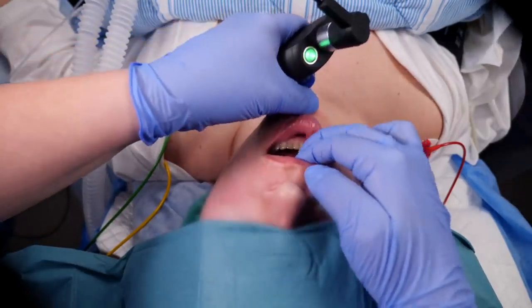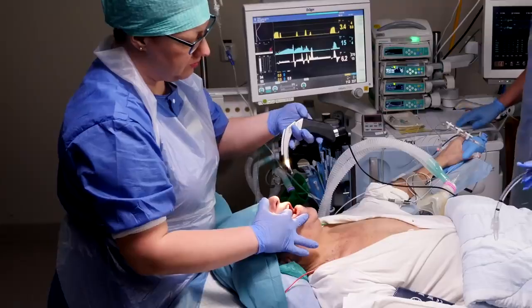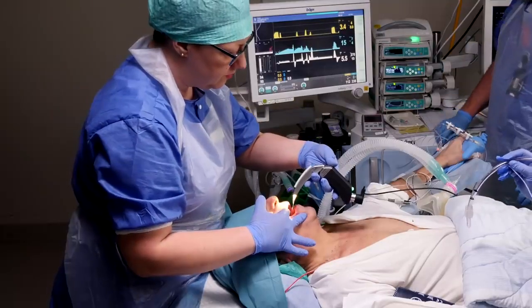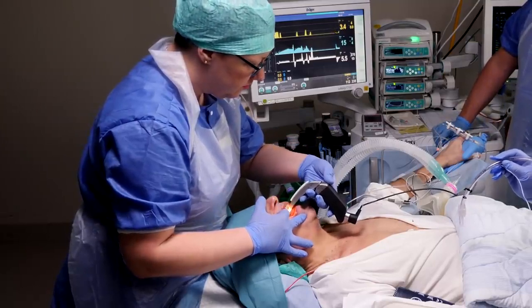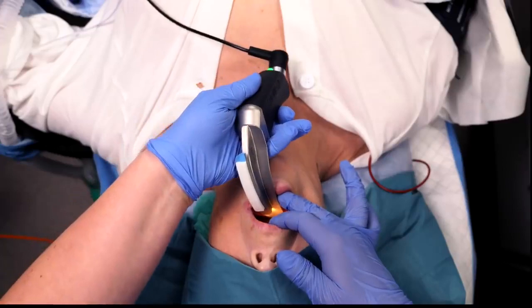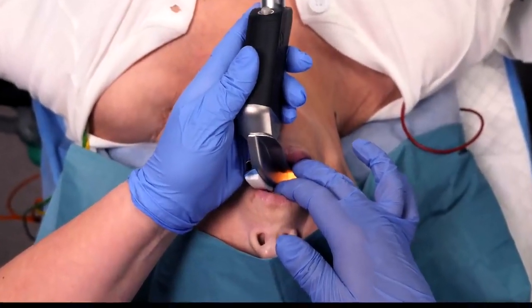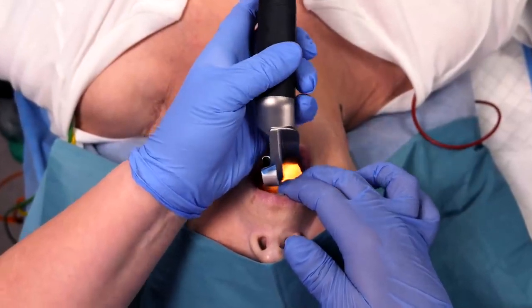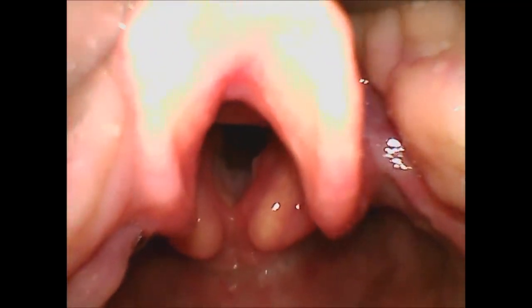Open the patient's mouth with your right hand and hold the laryngoscope in your left. Not too tight, with 3 or 4 fingers as close to the blade as possible for precision and control. Insert the blade in the right side of the mouth, carefully pushing the tongue aside. The aim is to create an unobstructed line of sight to the larynx by pushing the tongue to the left and lifting the epiglottis, exposing the vocal cords. This requires precision, not brute force.